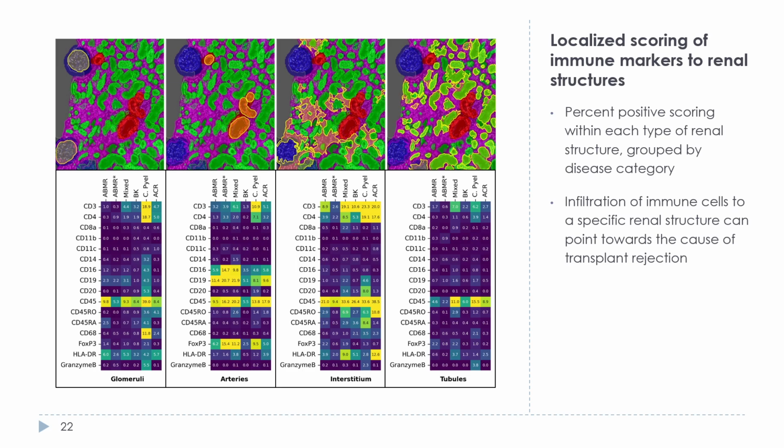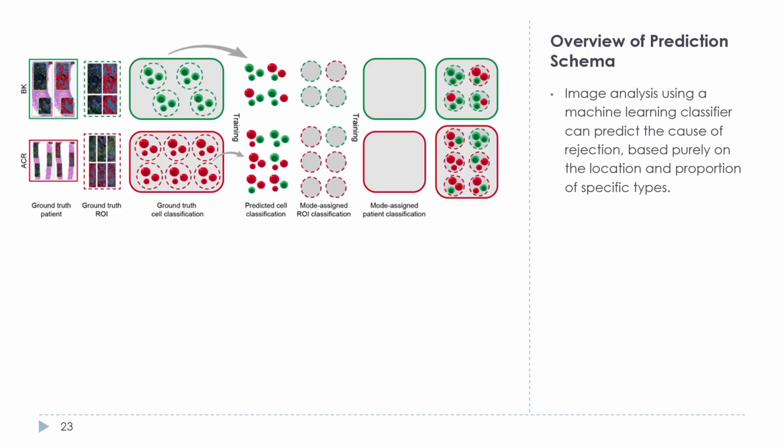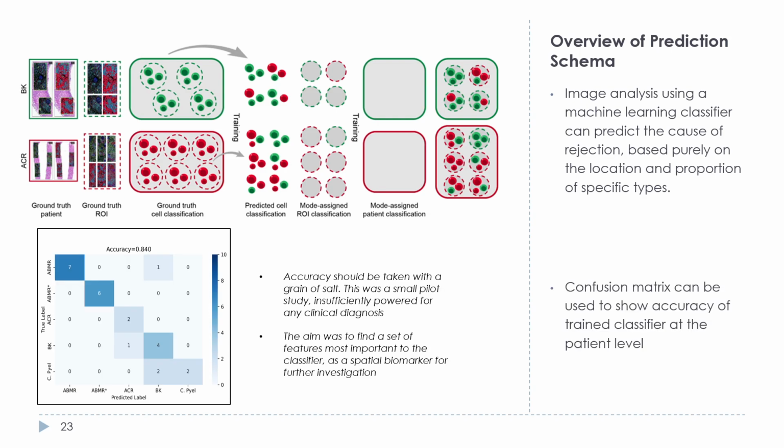But we'd also like to investigate spatial features associated with the heterogeneity we've observed across our patients. So as part of this study, we have created a framework for predicting categorical variables from supplementary sample categories. And this isn't just limited to kidney transplant rejection categories. This can also be applied to any feature of a dataset in which comparisons across one or more groups is needed, such as differentiating a control from experimental treatment category.